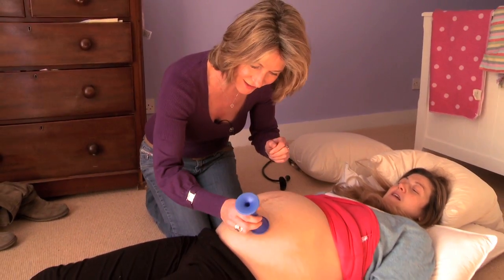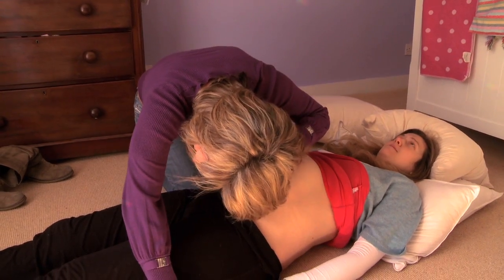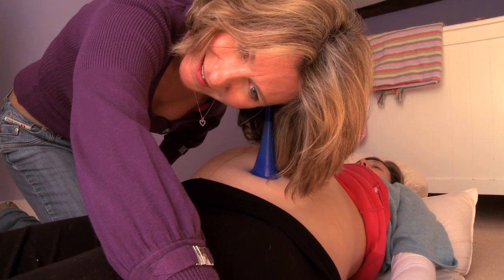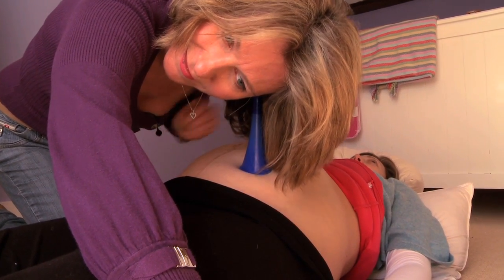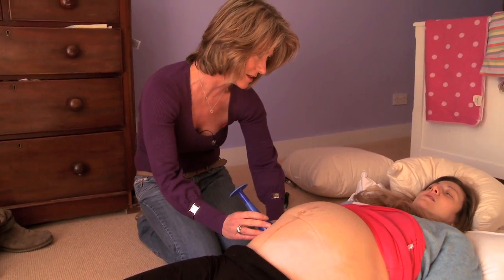So I'm going to use the pinnards. She goes over here, over the baby's back. I can hear that loud and clear, Louise. It sounds lovely. I'm right over her back here. So if she was over here, I'd be able to hear it on this side.